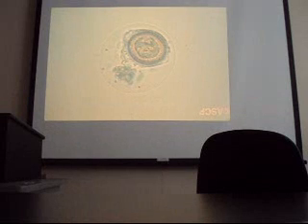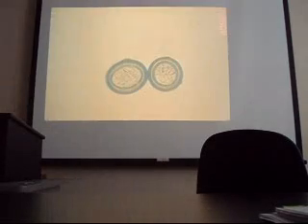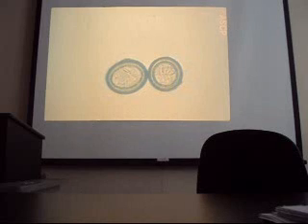So what's this egg? Taenia egg. What are the two Taenia? Solium and saginata, pork and beef. But I can't tell the difference in the eggs. Round, yellow-brown egg. Here's the embryo. But look at the thick shell with little striations all through it. And usually this membrane is absent. And we just see the egg. Here's some more Taenia eggs. You can see some hooklets in one of them.